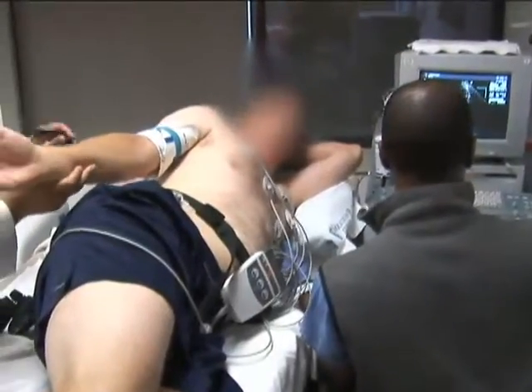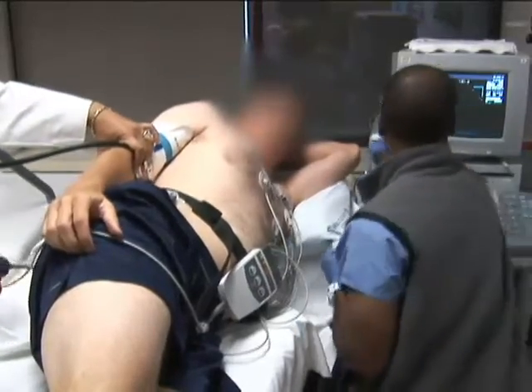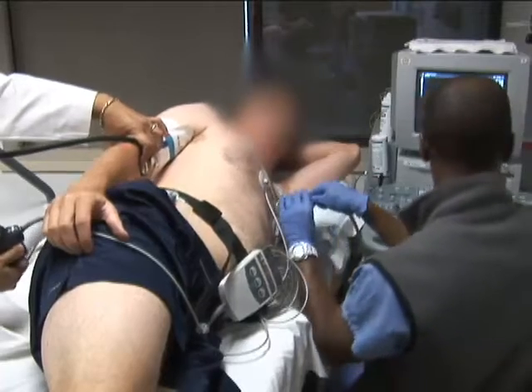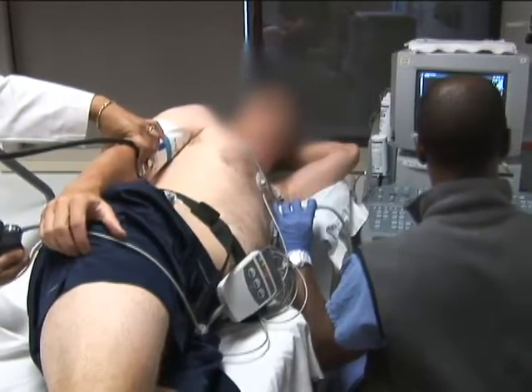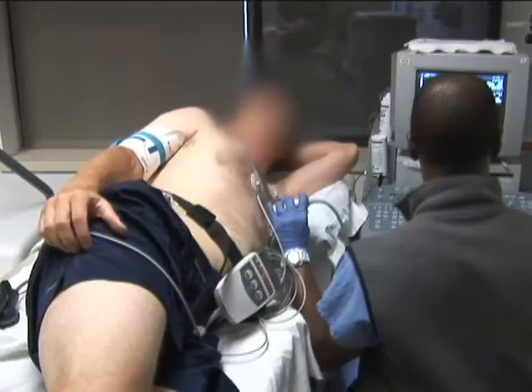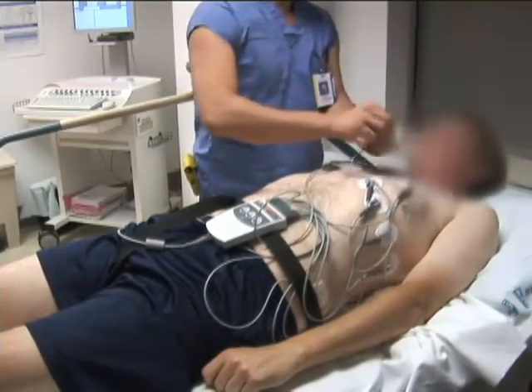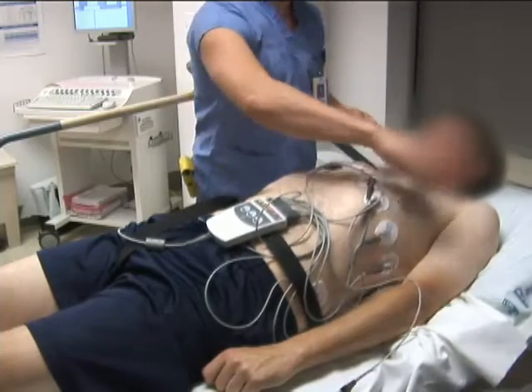Blood pressure and heart rate are recorded, and the patient is asked about anginal symptoms. The patient is monitored until heart rate returns to baseline. If stress-induced ECG or echocardiographic abnormalities are seen, patients should be monitored until these abnormalities normalize. The ECG leads and IV lines are discontinued, and the patient is dismissed from the laboratory.